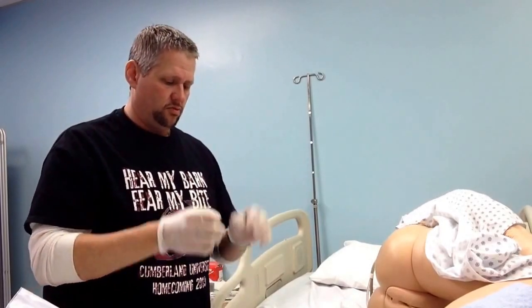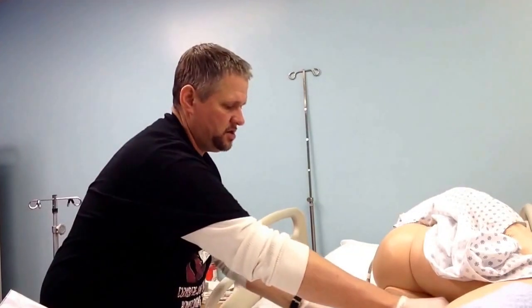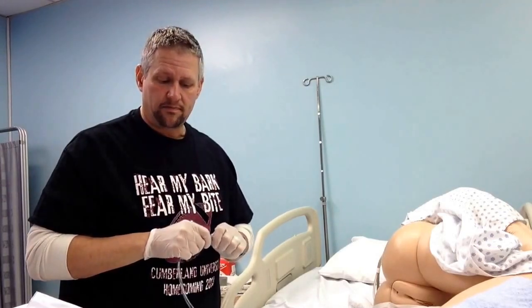Alright, I'm going to go ahead and remove the contents from my enema kit. I'm going to put the drape underneath the patient. And then I'm going to use the KY jelly, and I'm going to lube up the end of the tip very generously, making sure that it is covered with plenty of KY jelly.